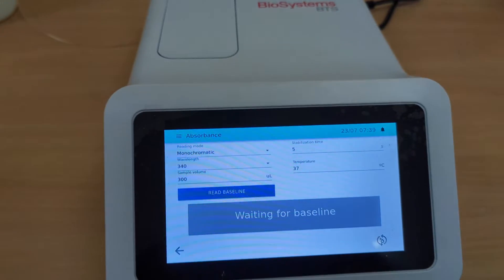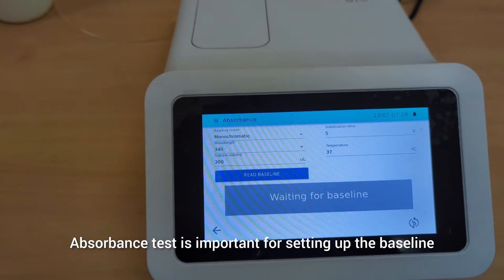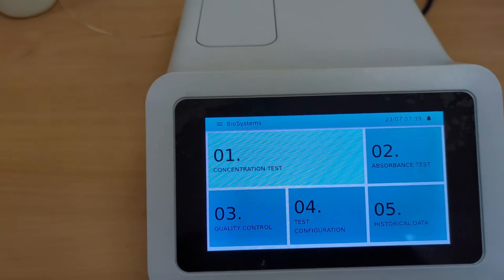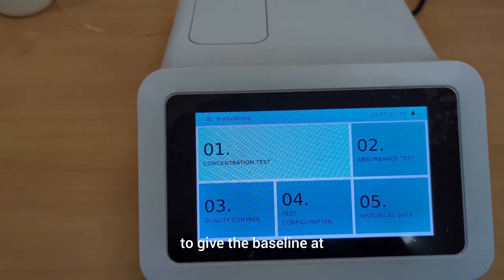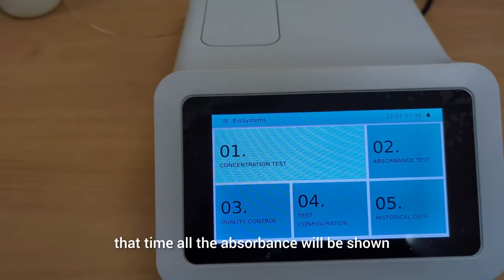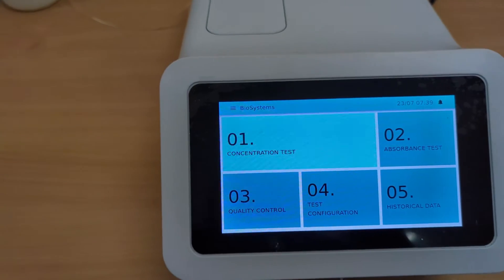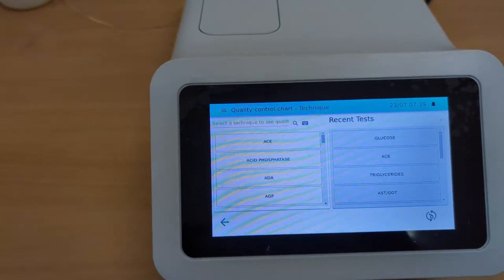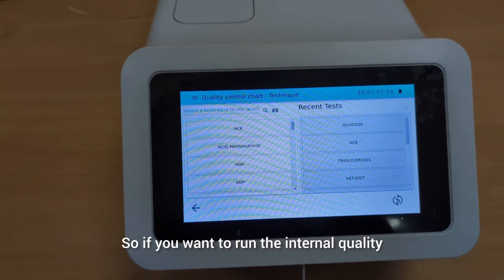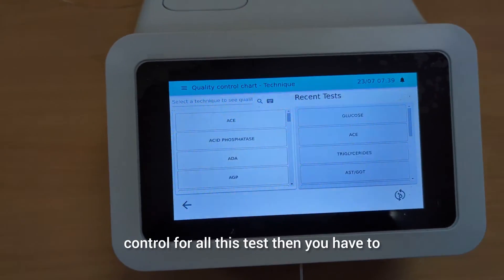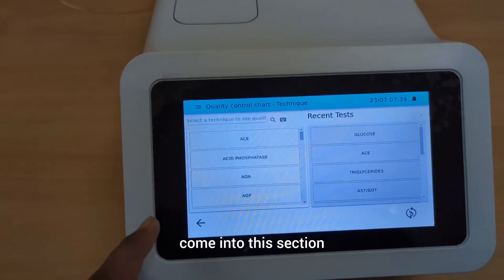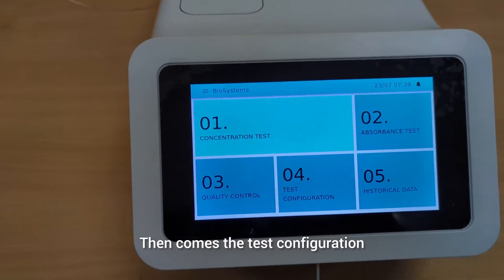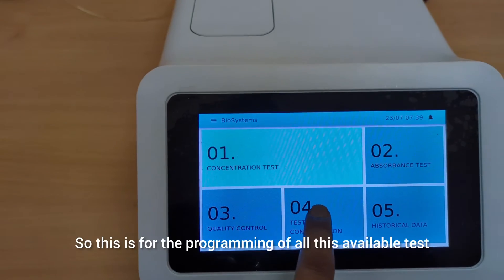Just beside the concentration test, there is an absorbance test. The absorbance test is important for setting up the baseline. When you run distilled water to give the baseline, all the absorbance values will be shown in the absorbance test. The third section is quality control — if you want to run the internal quality control for any test, you have to come into this section.